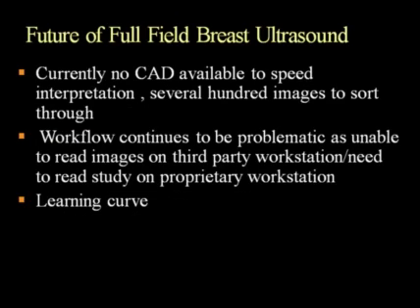So the future of full field breast ultrasound. Currently, we don't have computer-aided detection. That would really help speed interpretation because there are several hundred images to sort through. And workflow continues to be problematic as we're not necessarily able to read the images on our third-party workstations. So while we're reading our mammograms, our handheld ultrasound, our MRIs, we should be able to read our automated breast ultrasound images too, but we have to read that on the proprietary workstation for the unit.